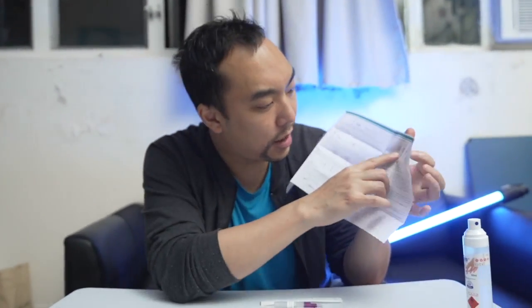I mean, but like if you have CT, you have COVID. If you just have C, you don't have COVID. And if you just have T, it's invalid. And if you don't have C or T, it's invalid. It's a very confusing test. And I should just do it now, right?